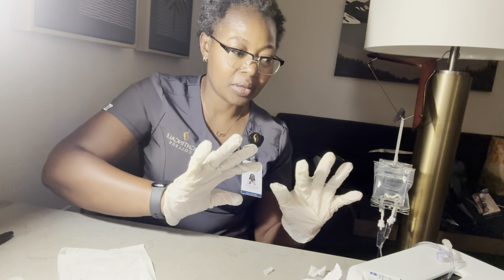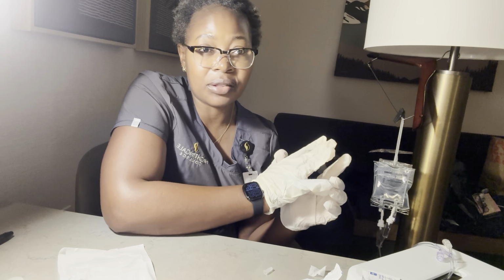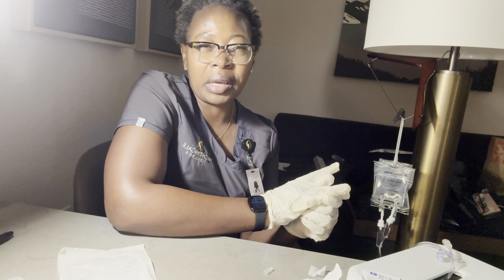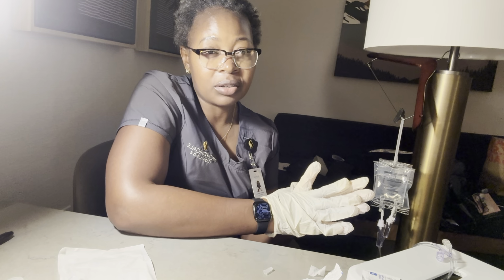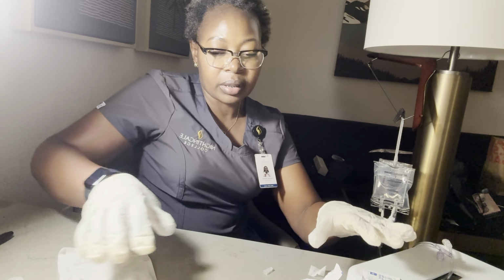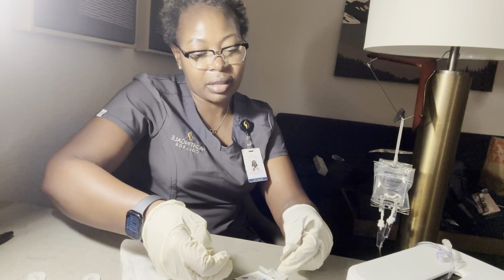Having made sure that the IV site has no infiltration, phlebitis, any pain, any redness or swelling, I will go ahead and put my patient into a comfortable position and provide a call light. I will make sure that I dispose of the unnecessary supplies.